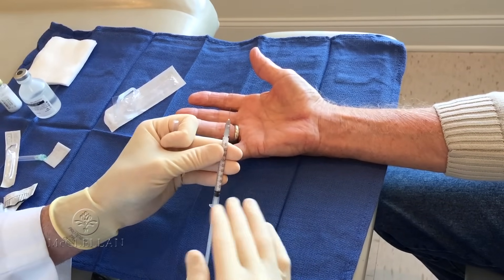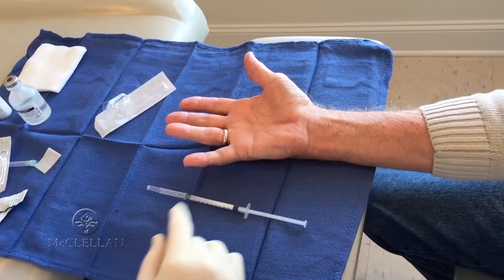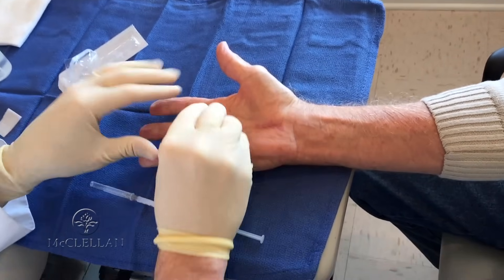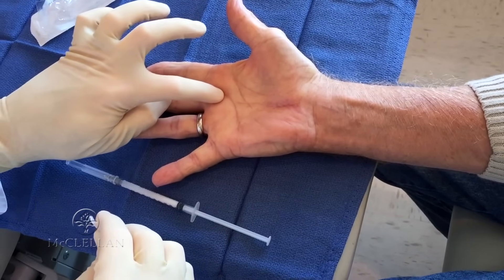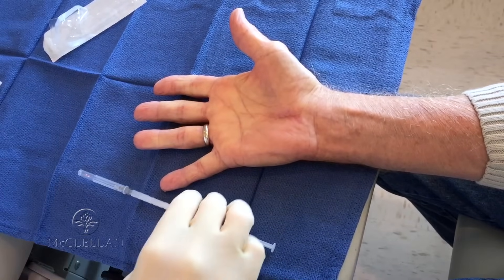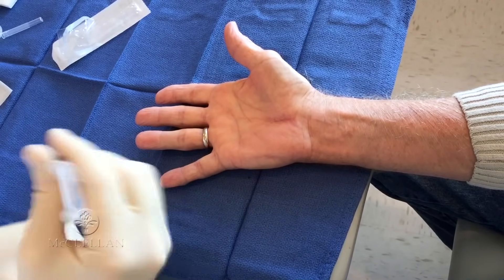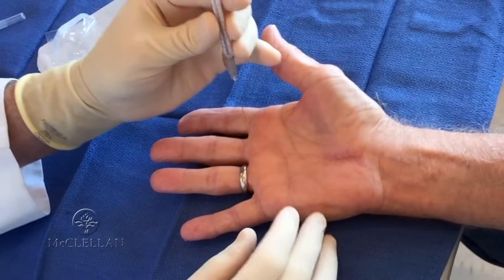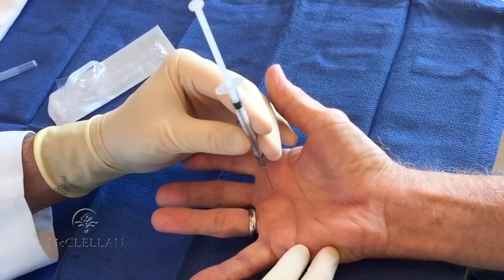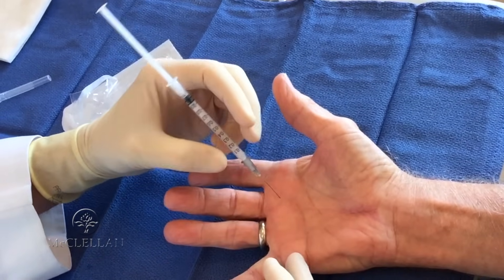I do not push it out of the end until I'm ready to inject because it'll clot the needle off. Okay, we're doing the middle finger and ring finger. Rachel, let's see if you can come more over it. He clicks right there, you can feel it — right there. So what I'm going to do is go in with the needle and talk to you as I do it. When I'm ready to go in I will squirt out a little bit, and I'm going to come down right in the middle of the finger.